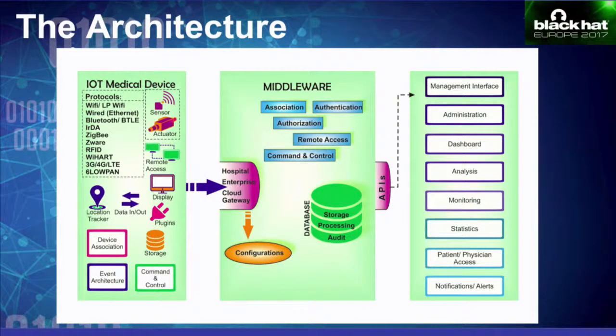Now, there's also a command and control, which we all love. Command and control can be used to remote into the device, either for the purpose of troubleshooting or for remotely upgrading firmware, making changes, and so on.